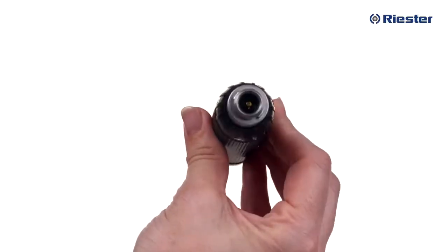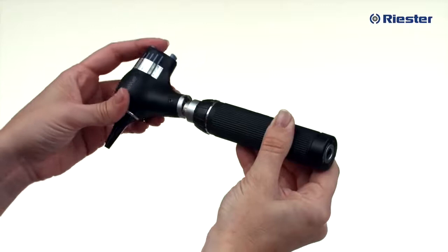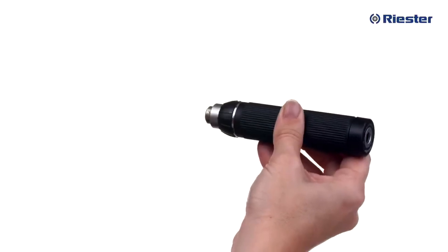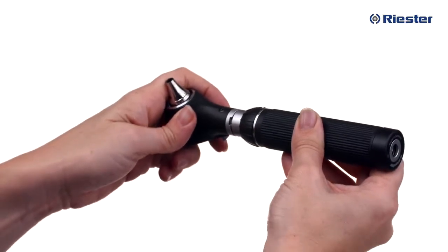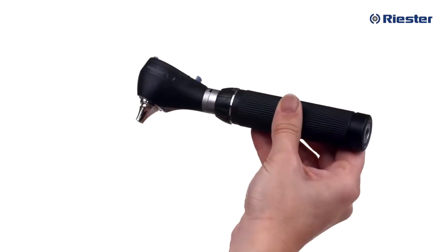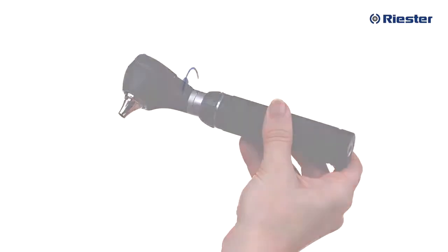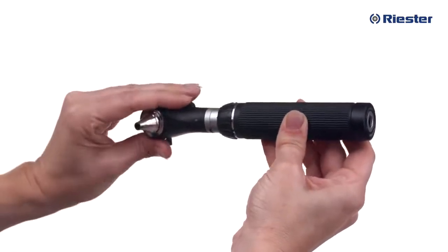Riester's bayonet fitting on the handle and on all the instrument heads in the RiScope L line allows for both the otoscope head and the ophthalmoscope head to fit interchangeably on the same handle. To attach your RiScope instrument head, simply line up the protruding parts of the bayonet fitting on the handle with the same fittings on the instrument head and turn the head clockwise until locked into place. To remove the instrument head, simply turn the head counterclockwise. You will feel the head lift up slightly once the bayonet fitting has been disengaged.